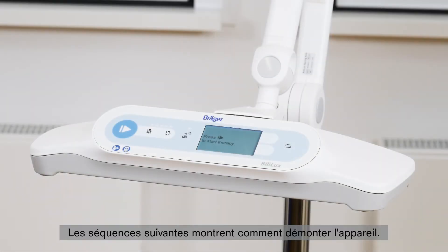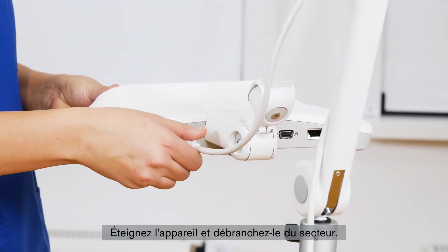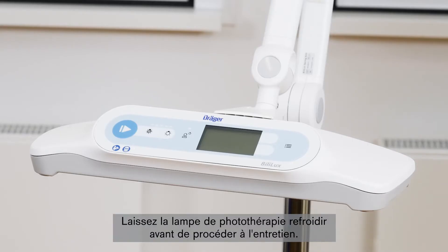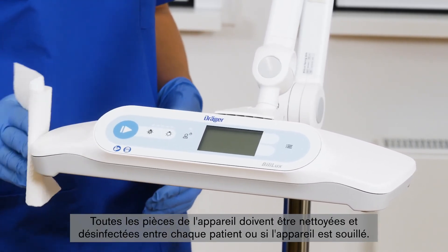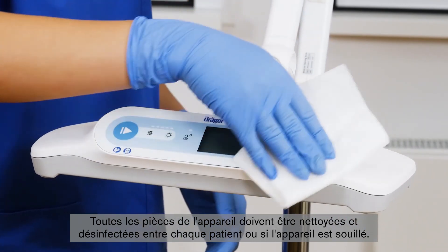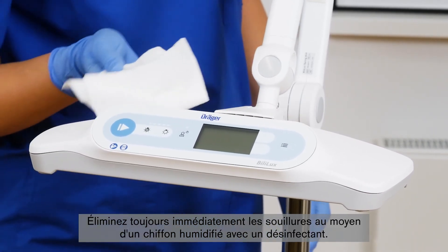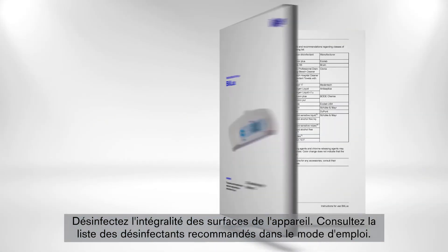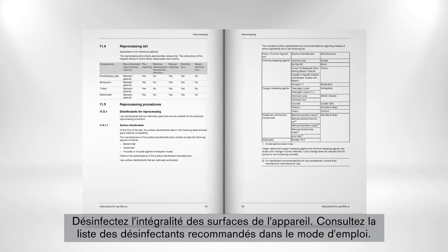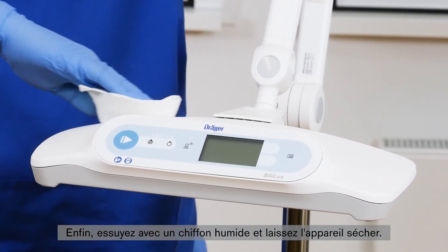In the following scenes, we will show you how to disassemble the device. Switch off the device and then disconnect the power plugs. Allow the phototherapy light to cool down before beginning reprocessing procedures. All parts of the device have to be cleaned and disinfected between every patient, or if the device has any soiling — always remove soiling immediately by using a cloth dampened with disinfectant. Perform surface disinfection of all device surfaces. Consult the IFU for a list of recommended surface disinfectants. Finally, wipe with a cloth dampened with water and let the device dry.